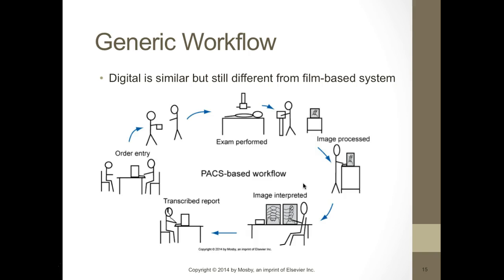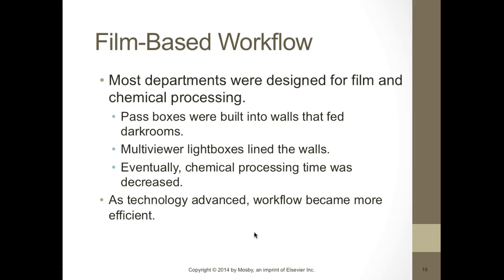Very, very extensive process. So when we look at the PACS-based workflow, the order goes in, there's no longer this person here. We still perform the exam, we process the image, it goes straight to the radiologist, and most of the time they use voice recognition software where they can actually transcribe it there, and they can QC it and get the report out with a turnaround time that's really fast. When we did the film-based systems, it took up to a week to get a report.